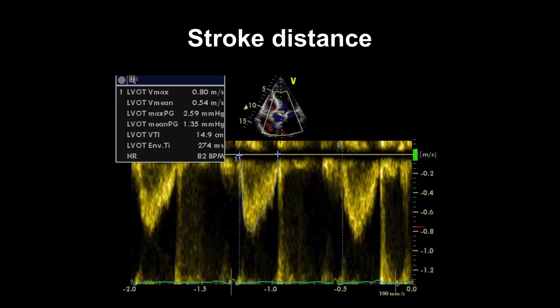Another way to describe LV systolic function is to view it in terms of how much blood is ejected, rather than using the change in the size of the left ventricle. And Doppler echo can be really useful for this. There are three commonly used measures: the stroke distance, the stroke volume, and the cardiac output. Let's start with stroke distance.